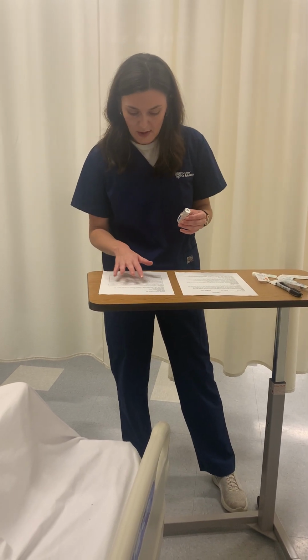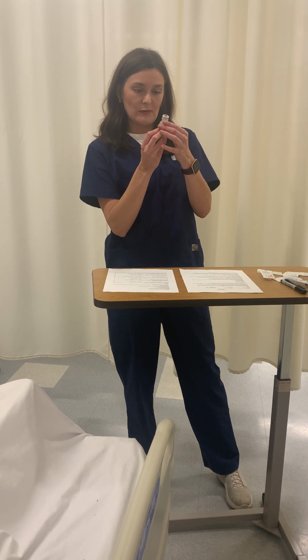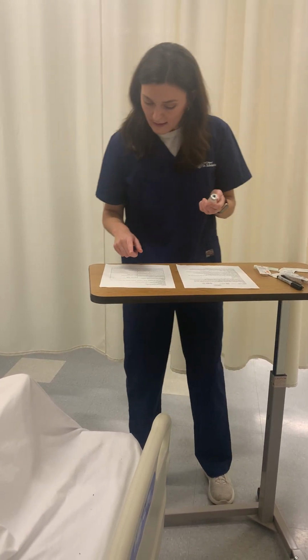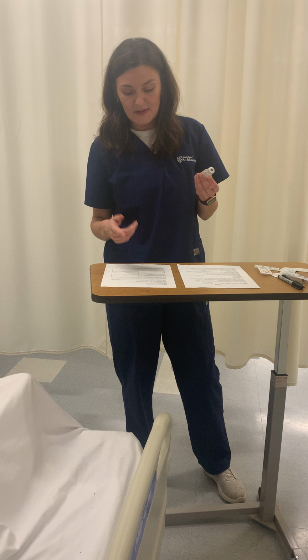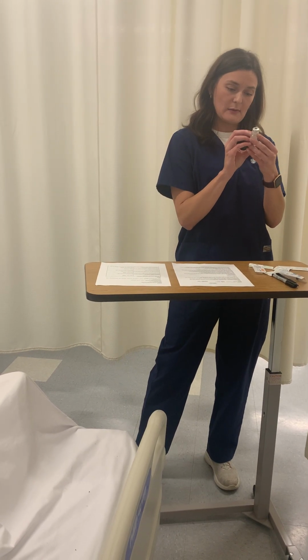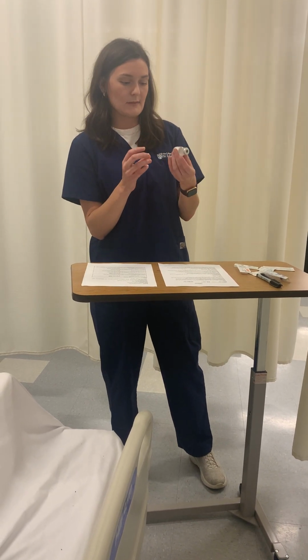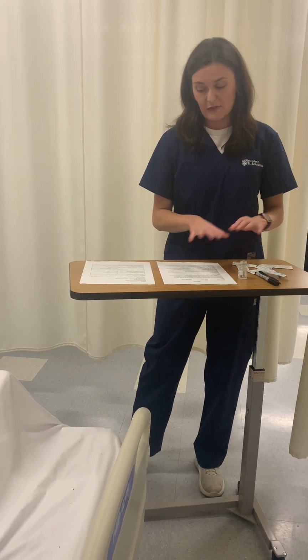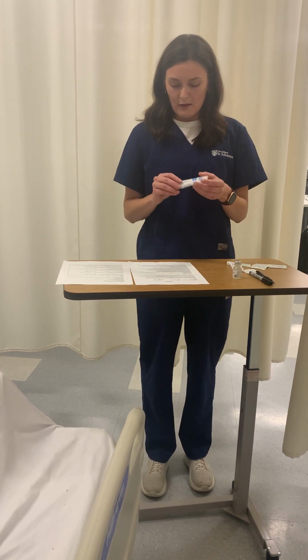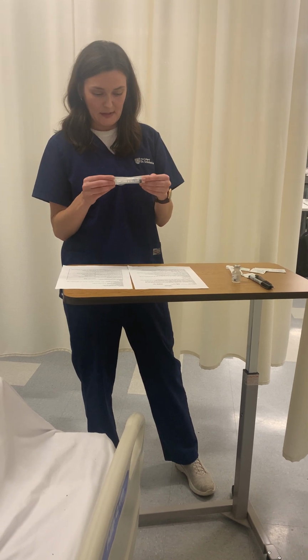The time is now. IM injection, or intramuscular injection. Okay. I'll shake it up a little bit. Okay. IM, the time now, the reason for the flu. Okay, so we've done our first check, and I'm also going to look at the expiration dates. Make sure the medication is clear, it's intact, and it is. So we're doing the first med check. Now I'm just going to gather my supplies to do this intramuscular injection. So we're doing 0.5 mL. So I want 0.5 mL. Good. It's intact.